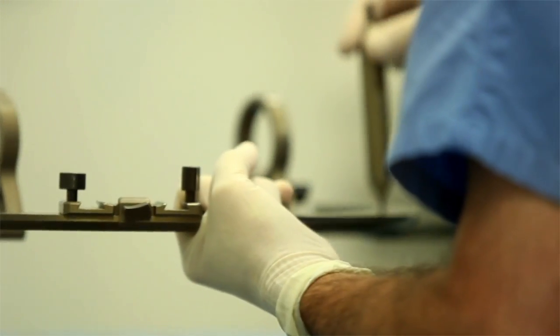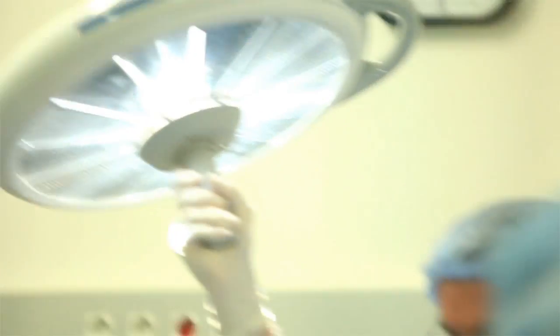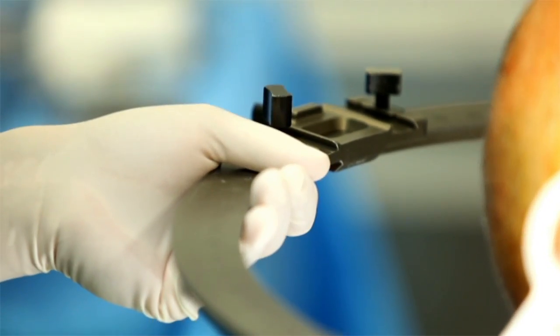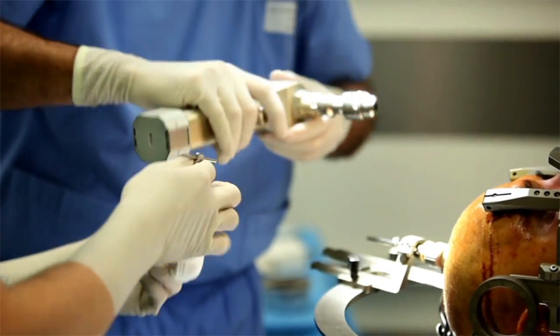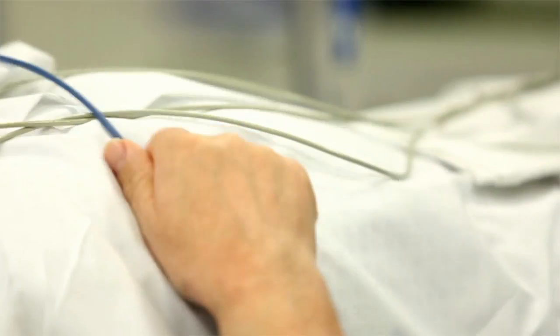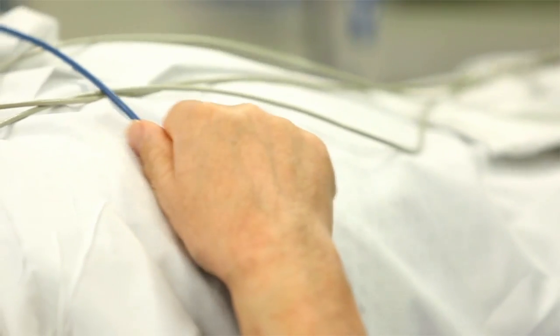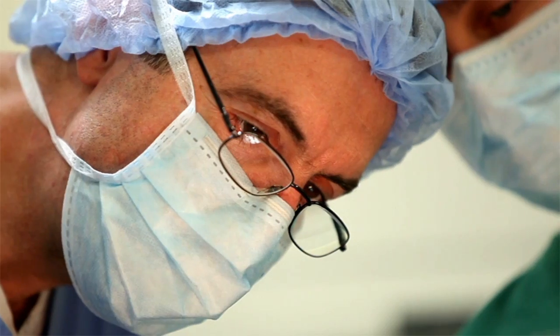The main interest of this accurate anatomical placement is that we are able to propose new kinds of trajectories to place electrodes in order to improve the patient, but also to reduce the adverse effects.